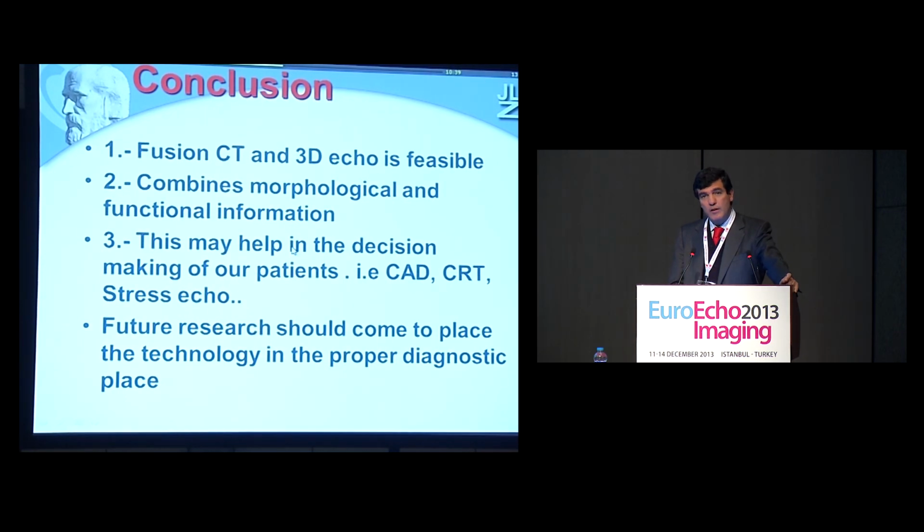We need for sure studies, hoping anyone wants to cooperate and start working with that, willing to do joint efforts together. This may help in some patients, like as I described, coronary artery disease is already giving us precious information. Sure that CRT may help in detecting exactly who are the non-responders. Just imagine delayed segment but no vein. Where are you going to place the lead? If there is no vein there, no need to place the lead, you can't, and this will increase the number of non-responders.